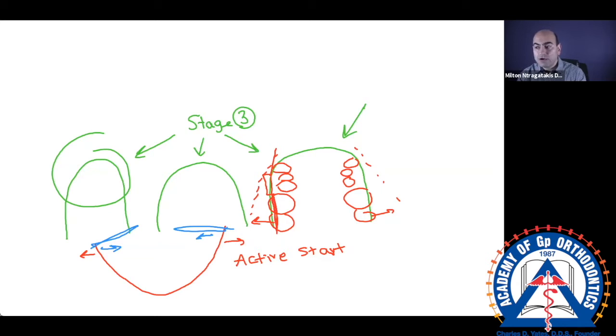If I don't have enough deflection, but anytime you put steps, you got to drop to a 16 stainless steel, because your steps on a 22 are going to be very aggressive.